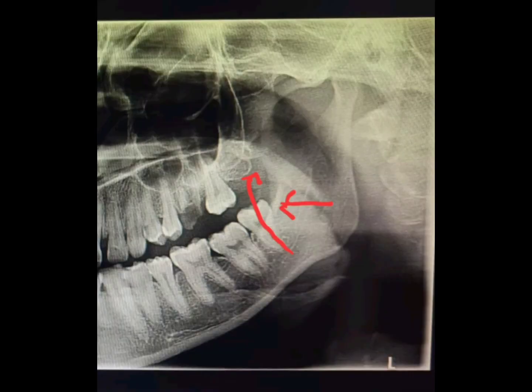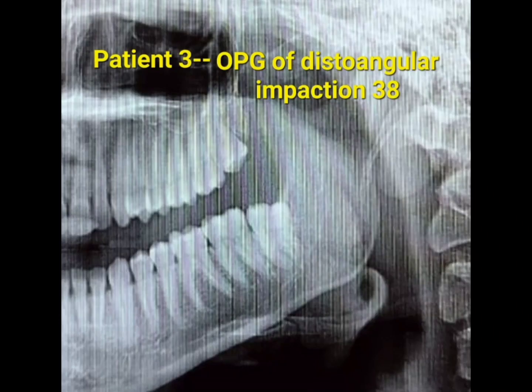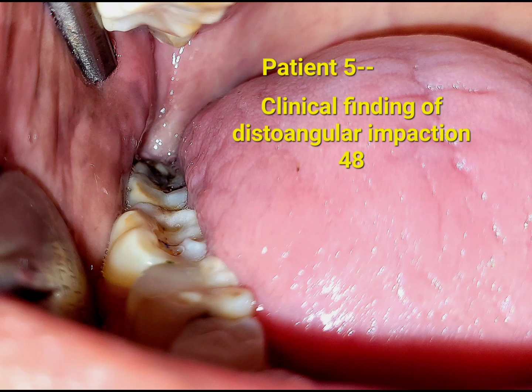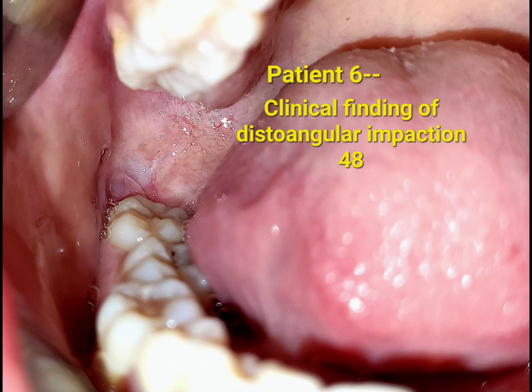The third reason: when the crown is fractured completely, it is very difficult to see the roots in direct vision, as they lie close and just immediately distal to the roots of the second molar. This makes them most difficult to approach with elevators. Careless, impatient, multiple attempts with the elevator can scratch the roots of the second molar. Cementum will get destroyed, or even the roots are injured and luxated. This will lead to post-operative sensitivity, mobility, or even a non-vital second molar.